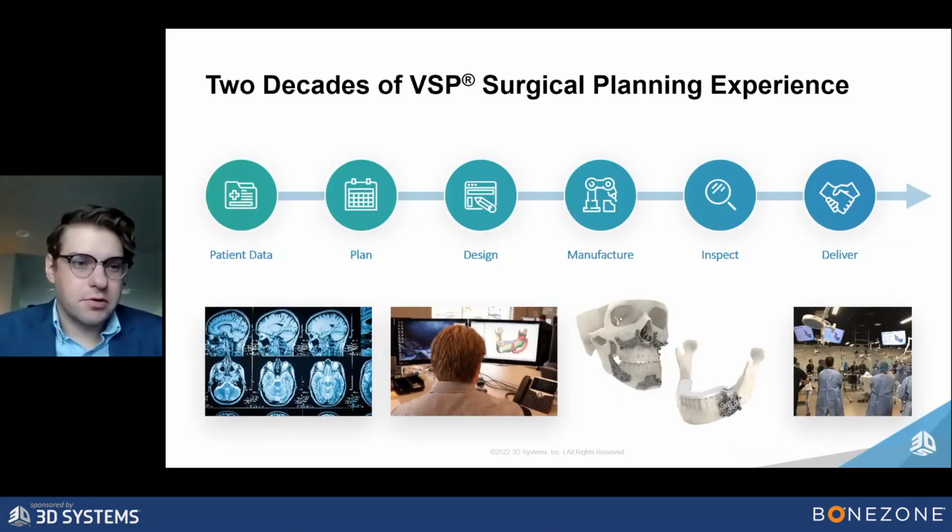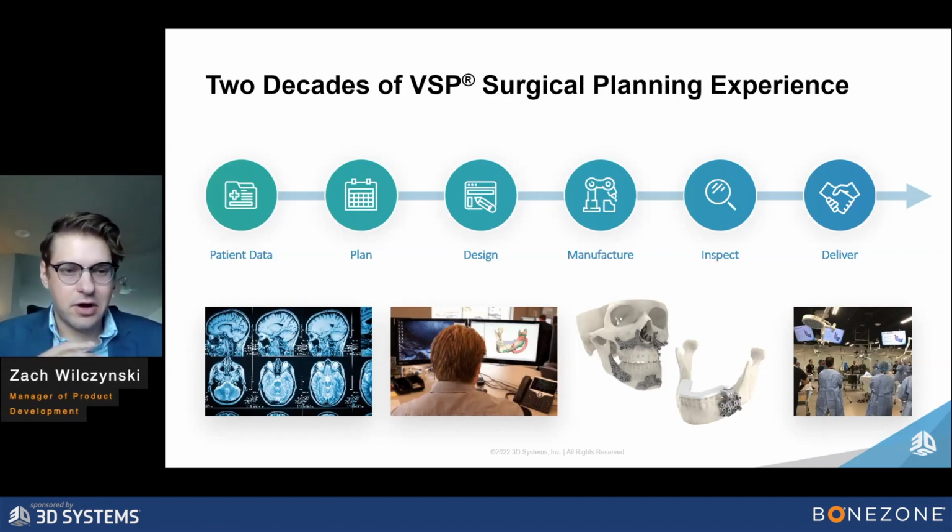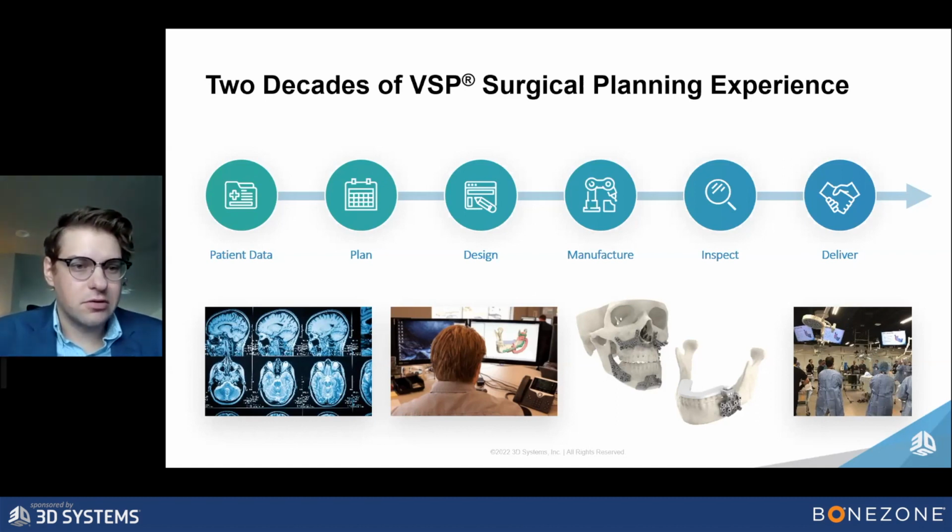Zach? Thanks, Ben. To start with, I just want to walk through the digital workflow that's associated with the personalization or patient-specific medical devices. And 3D Systems has over 2 decades of VSP, or virtual surgical planning, experience. And no matter what application we're working on, whether that's a craniomaxillofacial application or a spine application, we've got a pretty standard workflow that we go through in order to create personalized medical devices.